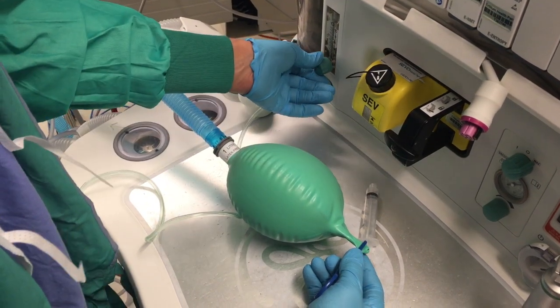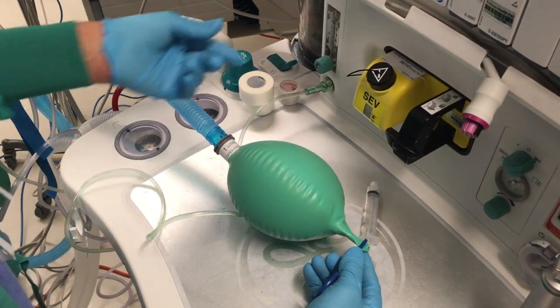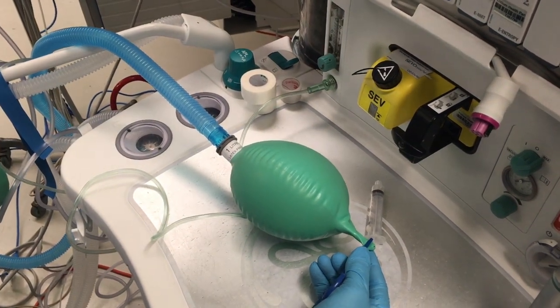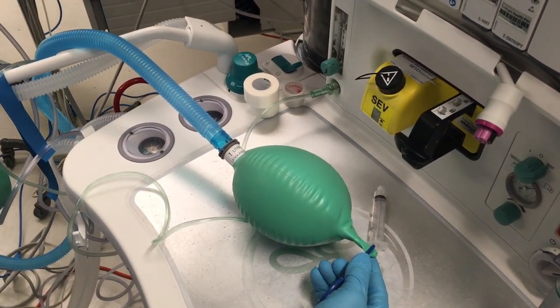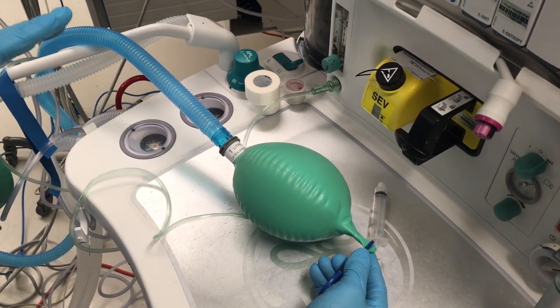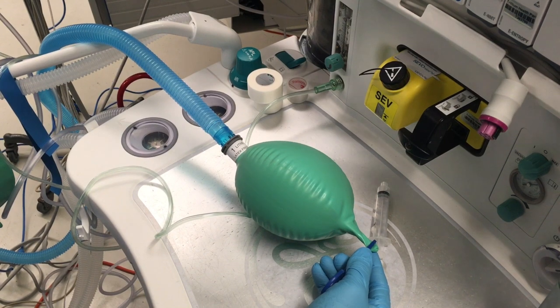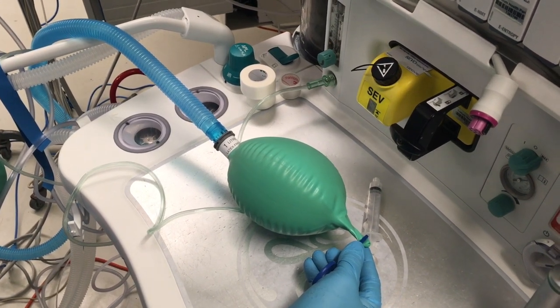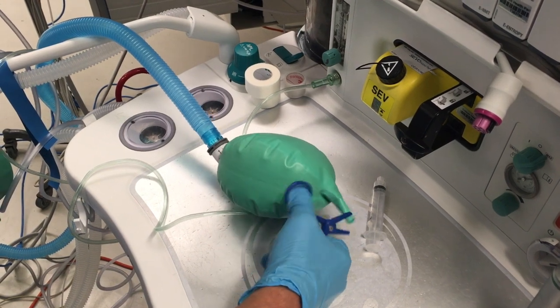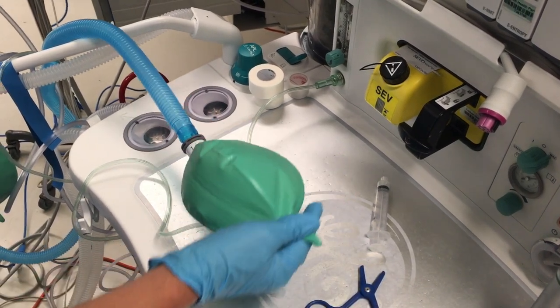The pressure, when the wrinkles all come equally in the bag, tends to be around 15 centimeters of water. When those wrinkles disappear, it's about 20 centimeters of water. So when all the wrinkles are gone, the bag begins to expand. The pressure is about 25 to 30 centimeters of water. And of course, when the bag continues to expand to infinity, that's 40 centimeters of water.